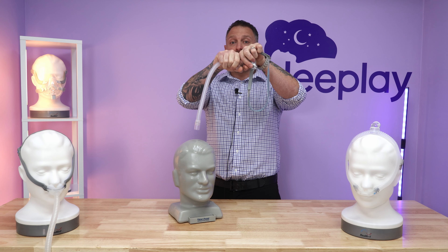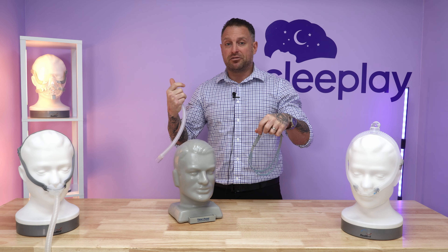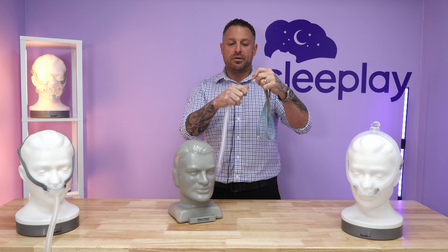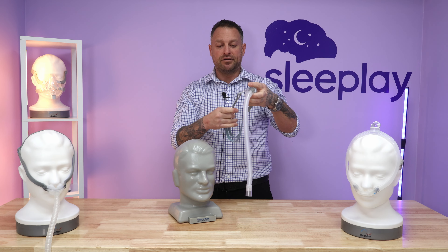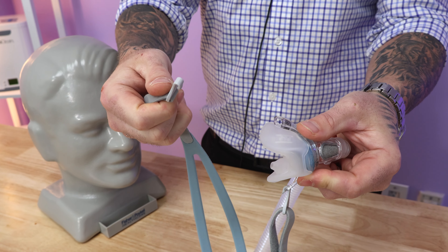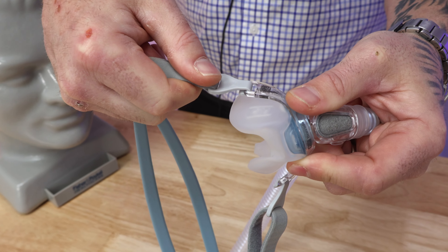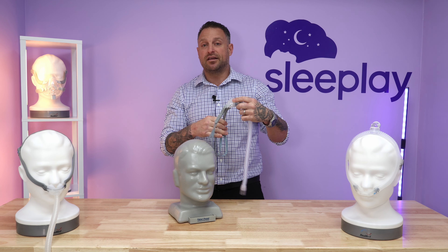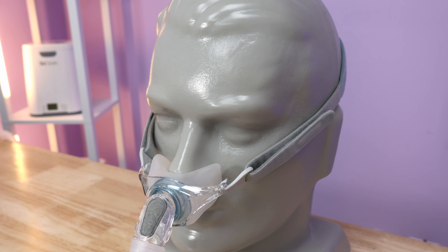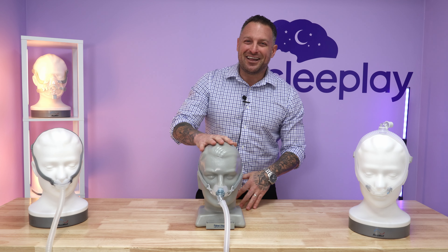With the P10, all you do is just bend the tubing from the mask to the tubing from the machine, go to the bathroom, come back, connect them again. This one here, you can literally just pull off, go to the bathroom, come back, and snap it back on — very simple. The way you take this headgear off: it's got little U-shaped clips that go around the bar. You just pull this and snap it back in — you hear a snap and you're good to go. With this mask, you can wash everything together in warm, soapy water.